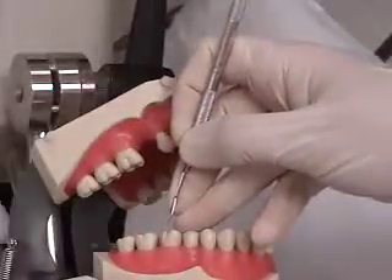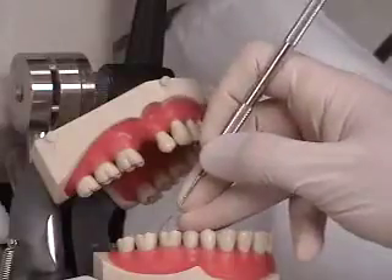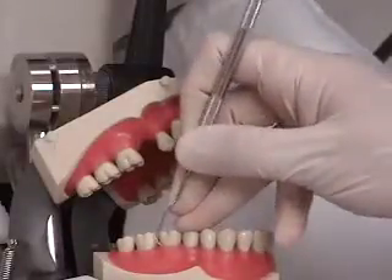In this video we see the use of the EXD 1112 Explorer on the posterior teeth. We start at the line angle and move into the interproximal.